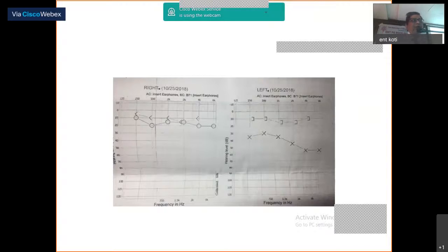So how do they do the recording? First, the patient is explained, after putting on the headphones or speakers to deliver the sound to the ear, that he will hear a sound, and then that sound will be increased and decreased around the threshold at which the patient says, I can hear and I cannot hear. So that is done in steps of 5 decibels, minus 5 decibel, plus 5 decibel.